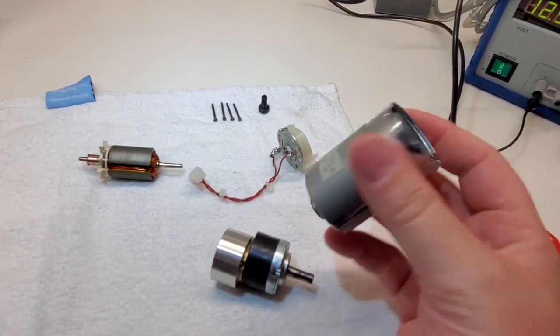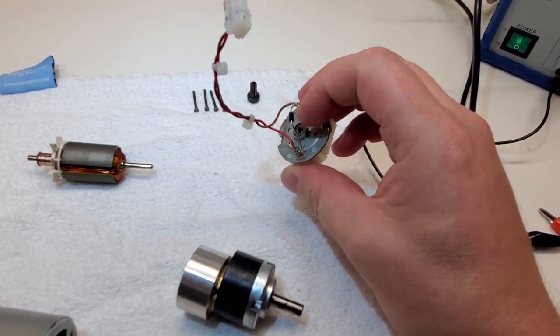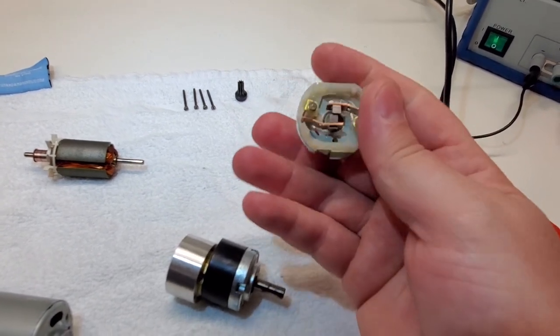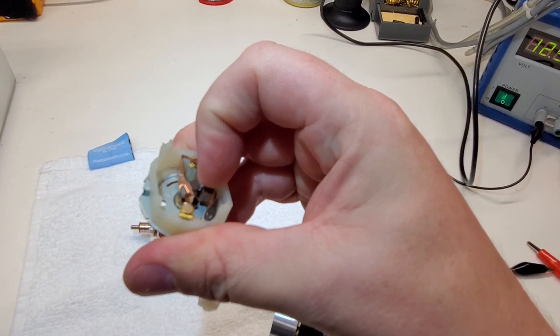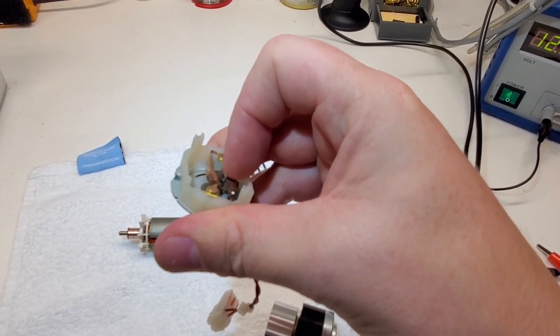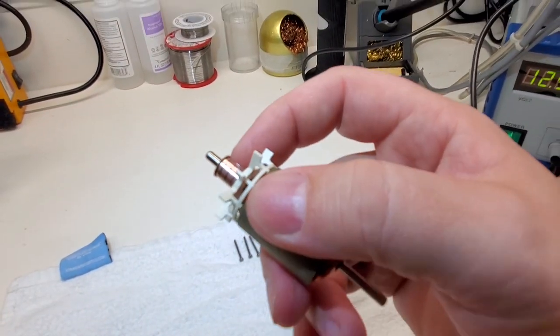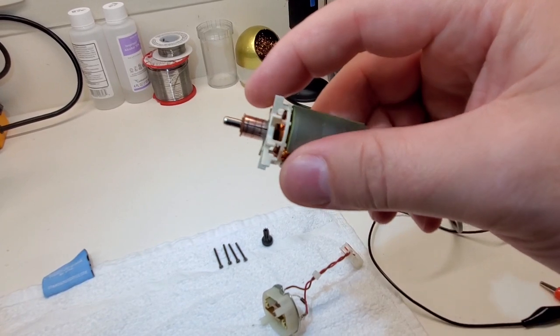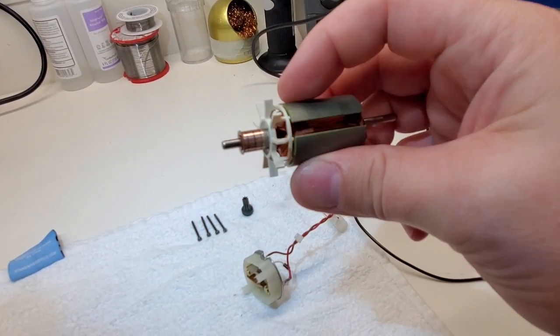First off, this guy was real fun breaking into. You can see right here, this is the back plate with the shunt diode. And there's your brushes. Now, if we take a look at these brushes, see if I can separate them enough. You can see that they got a comb pattern. You see the three little combs on the brushes and they will rub right here. You see how I got those three slight indents? So there's not very much wear and tear on this.